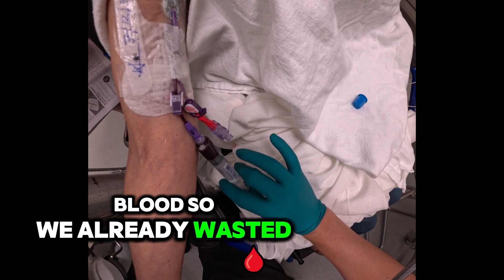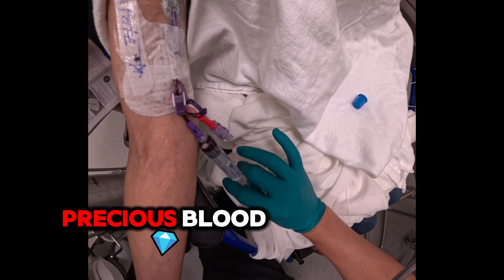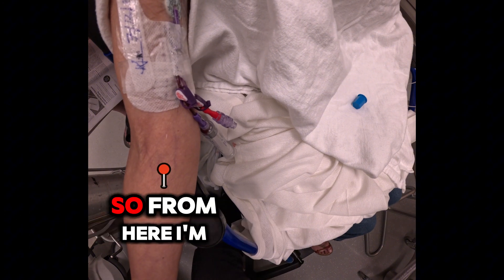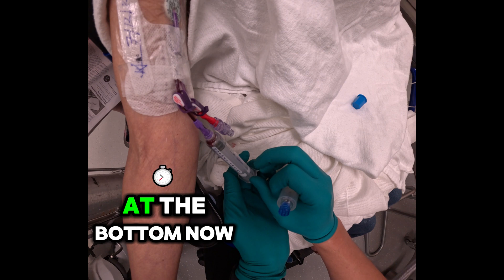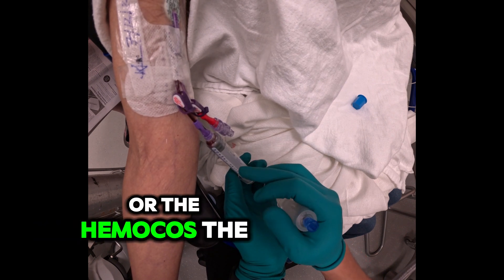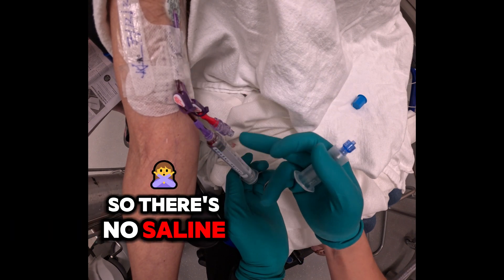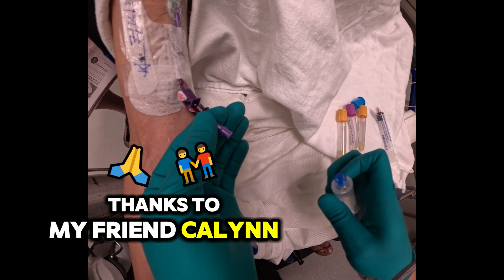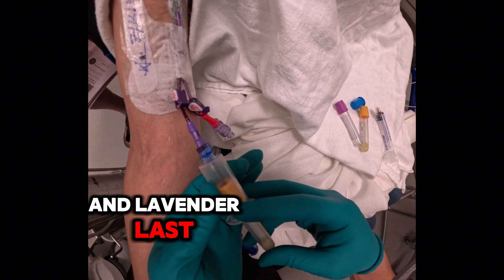We already wasted like 20 ml, so I don't want to keep wasting any more of her precious blood. We're going to save as much as we can to prevent iatrogenic anemia. I'm going to clamp. What happens is that the whole blood at the bottom — the appropriate hemoconcentration — pushes back in so there's no saline to contaminate the chemistry. Thanks to my friend Kalin, I remembered we need to go yellow first and lavender last.